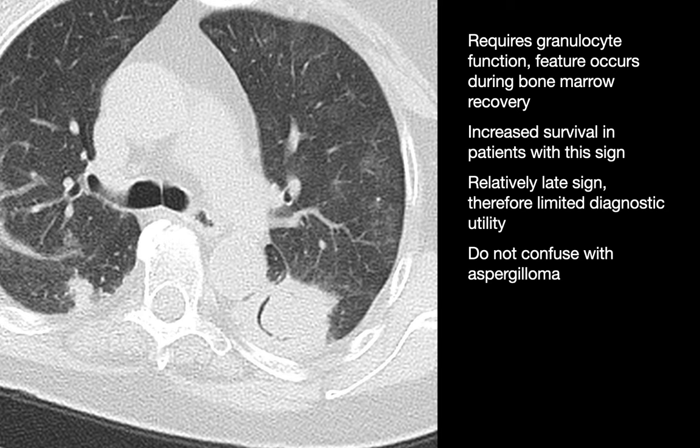We handle the differential according to the presentation of the patient. A patient with isolated ground glass opacities presenting with acute dyspnea: we tend to think of cardiogenic edema, flash edema, diffuse alveolar damage, or diffuse alveolar hemorrhage on more rare occasions. In a debilitated inpatient, probably the best answer is cardiogenic edema.